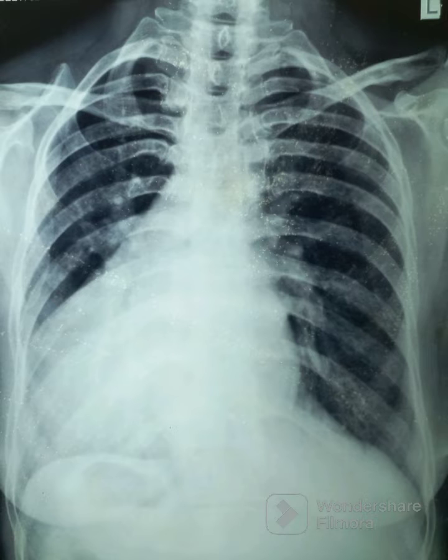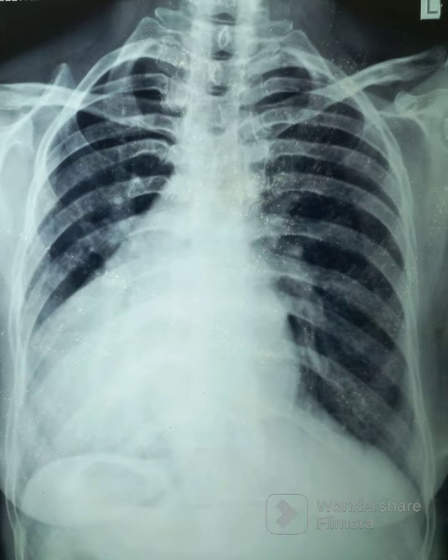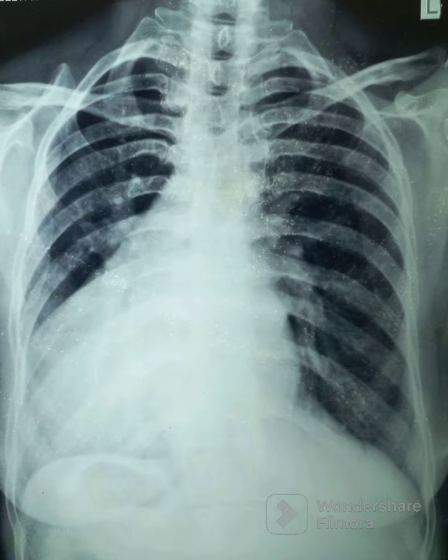The following findings are noted: cardiac shadow is on the right side. Note the marking for the left side 'L' on the top. Normally, cardiac shadow is expected on the left side. Since it is on the right side, it is a case of dextrocardia. The fundal gas shadow also appears on the right side.